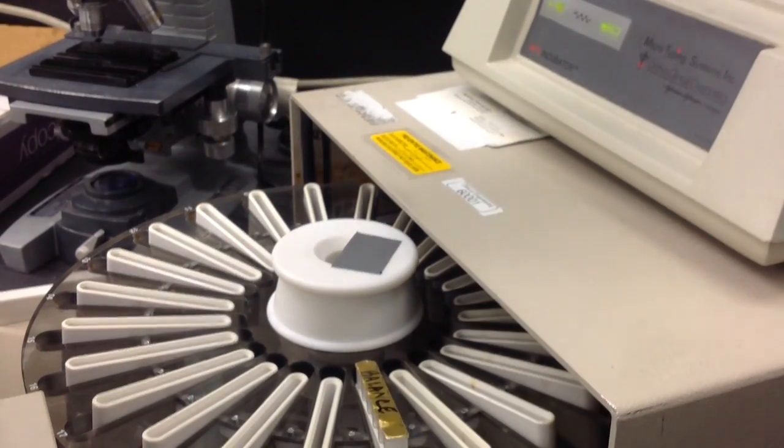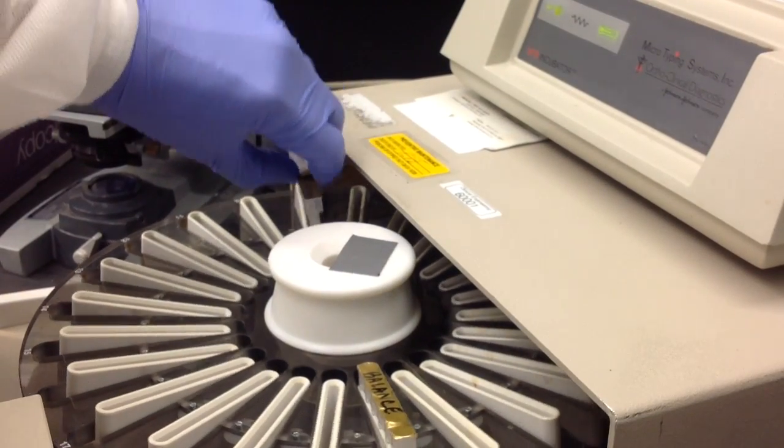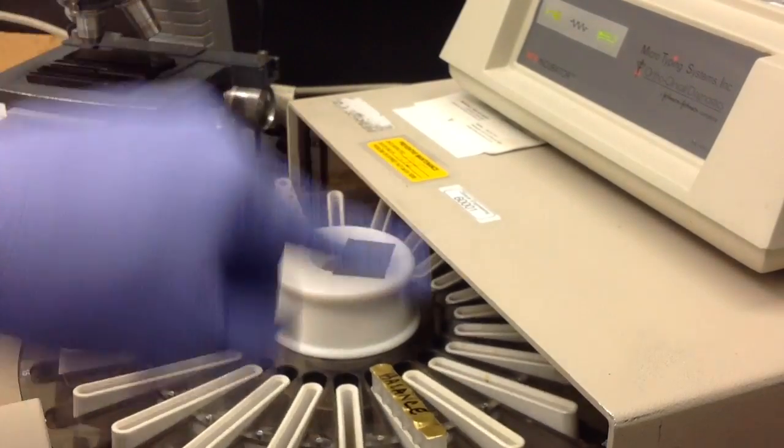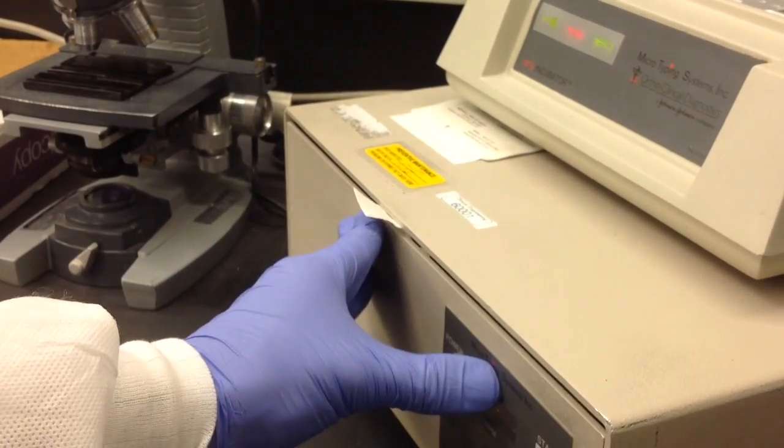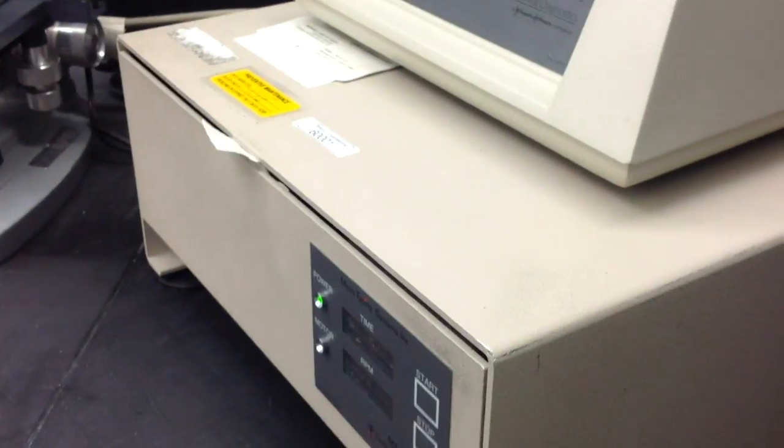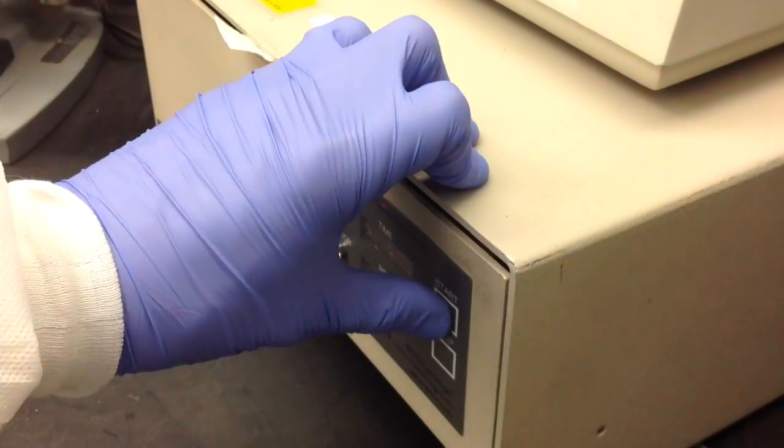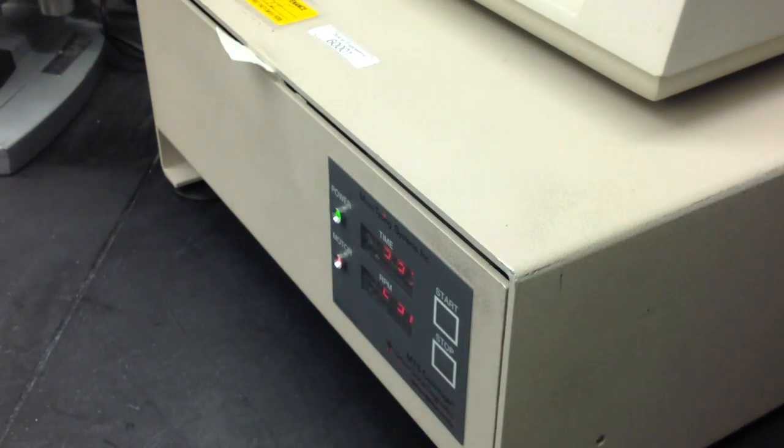Now it's important to make sure that you properly balance the centrifuge like all others. Usually you just have to sacrifice a gel card. This is going to run for 10 minutes and then after that we'll be able to read our reactions.